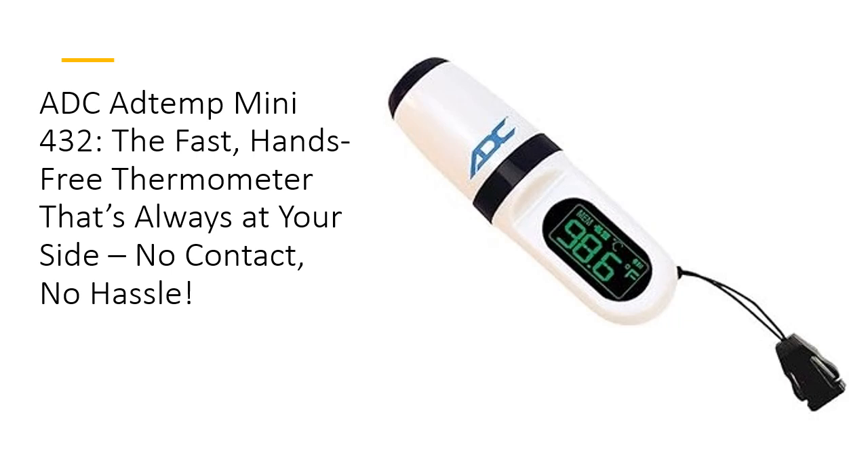With its non-contact infrared technology, this portable powerhouse delivers ultra-fast, accurate readings in just one second. No need to touch the skin, meaning zero cross-contamination and ultimate safety for busy professionals and households alike. Compact and rechargeable, the AddTemp Mini 432 is a true game-changer in effortless temperature-taking precision.